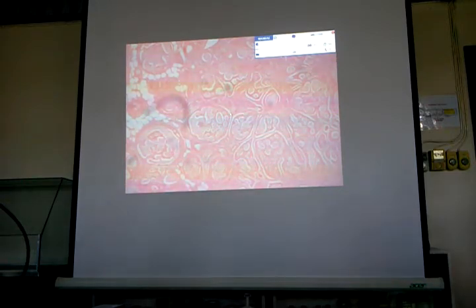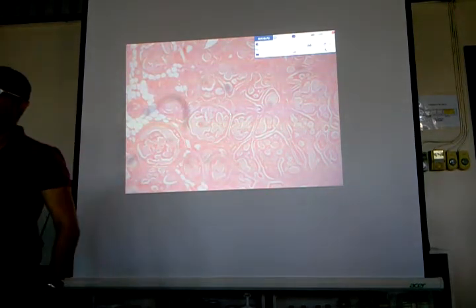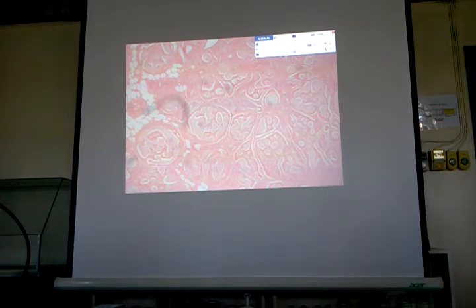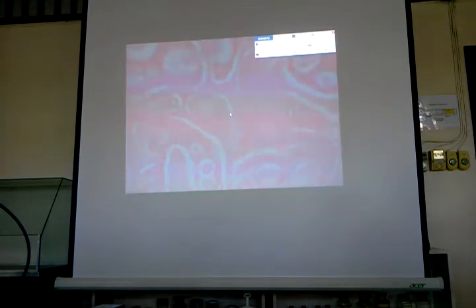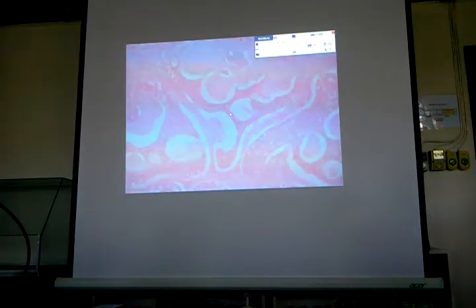Okay? So, kung tingnan nyo yan, para siyang sieve. So this is the characteristic pattern of arrangement that will be displayed by the tumor cells in adenoid cystic carcinoma. And then if you examine the tumor cells, they are almost uniform in size and in shape. They are cuboidal in shape.